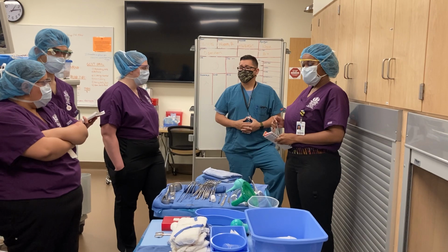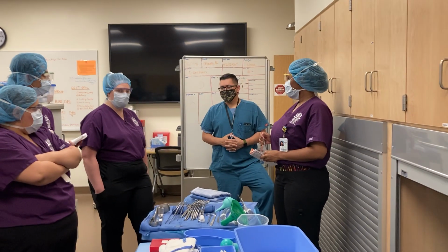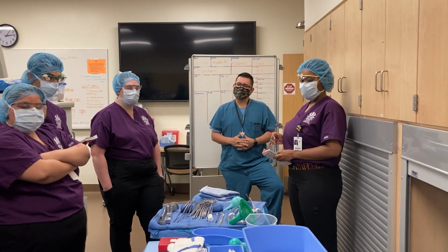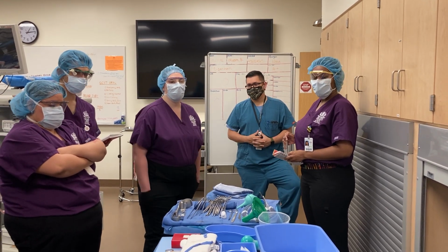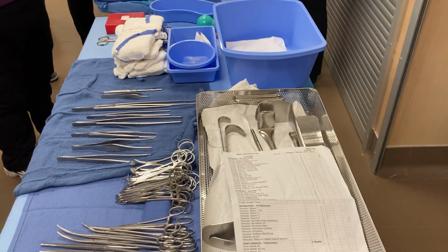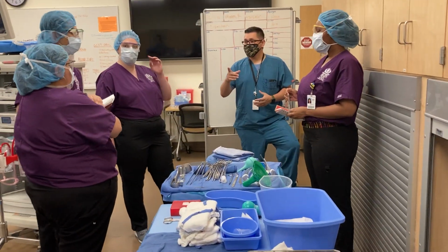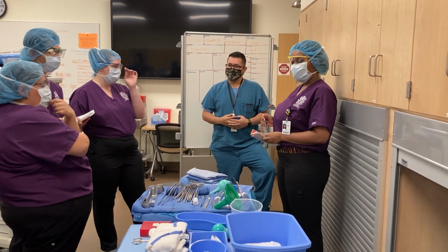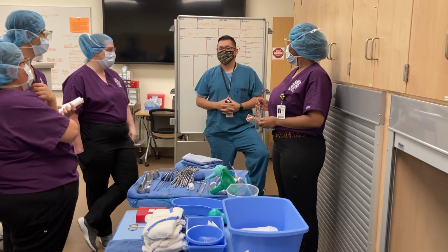Now comes the specialty of the C-section. The C-section tray will have a special bladder retractor. You guys kind of have one here. Anybody know what retractor that might be? Again, the word is special retractor for it. Now, the answer might not be in this setup, but the answer is definitely in a major setup. The wing nut is only holding on to the retractor, right? You're close. The Balfour is the whole set.